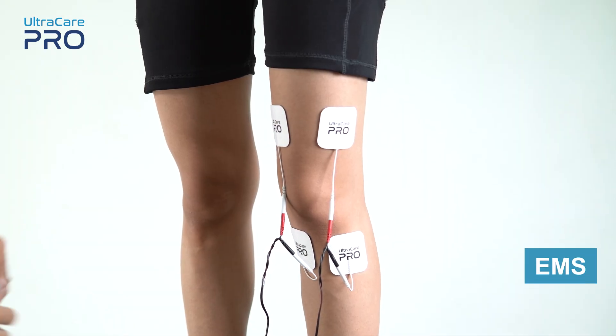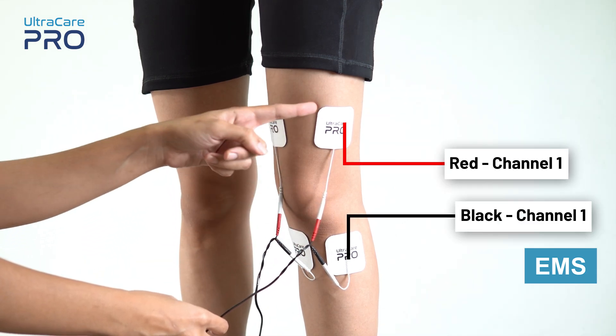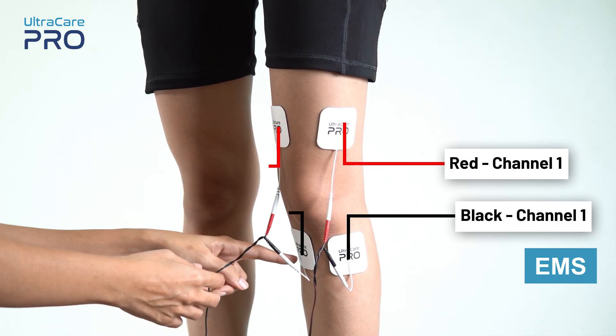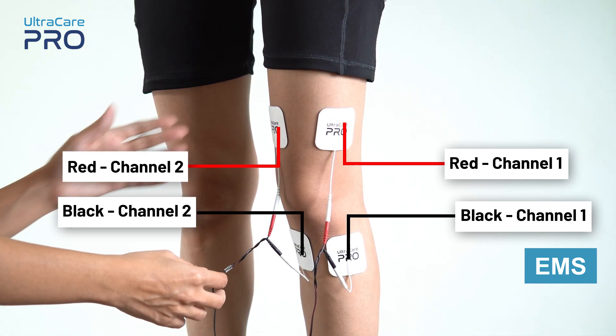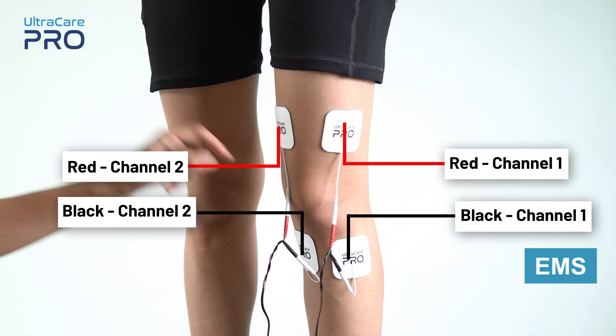For EMS application, place the red and black electrode from channel 1 on the outer side of the knee joint. Similarly, place the red and black electrode from channel 2 on the inner side of the knee joint. Remember not to place any electrode on the center of the knee joint.